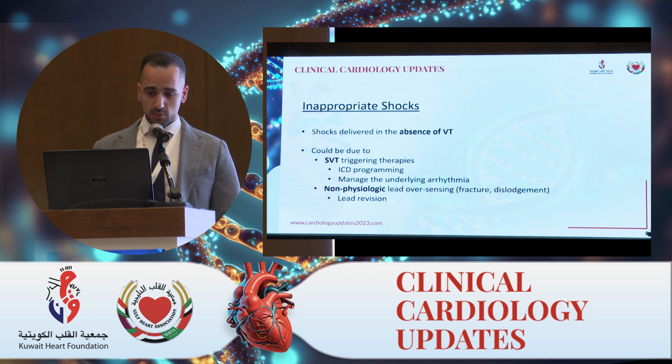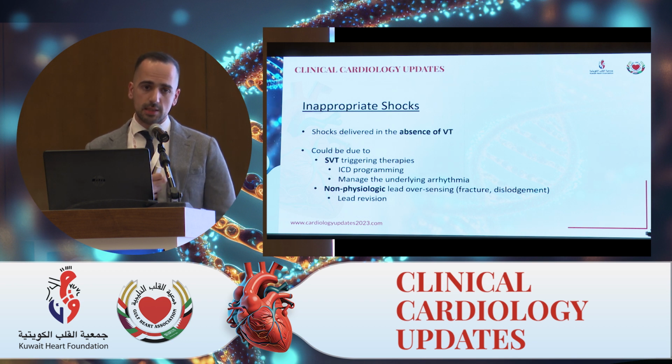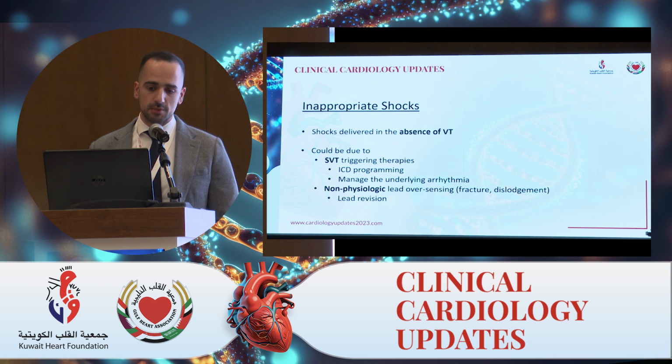This is one of the reasons we try not to put ICDs in everybody, or one of the concerns of putting an ICD in a patient. The last thing you want is to put an ICD to protect somebody for them to come back getting shocked by it for no reason. It is very painful and very traumatic.